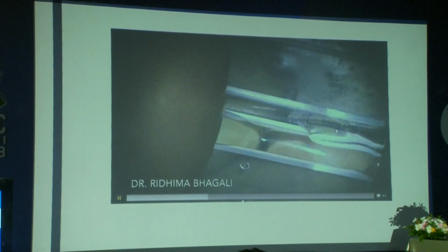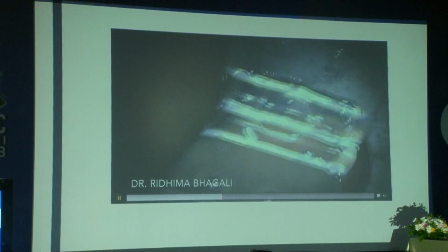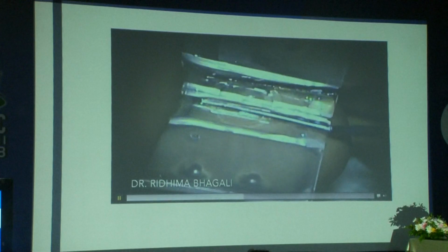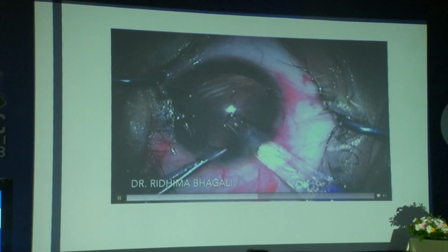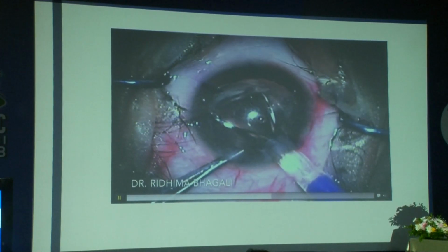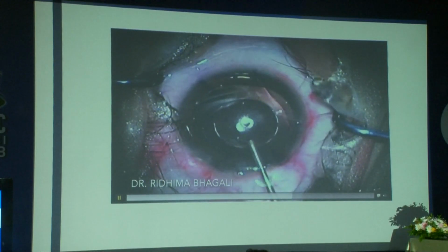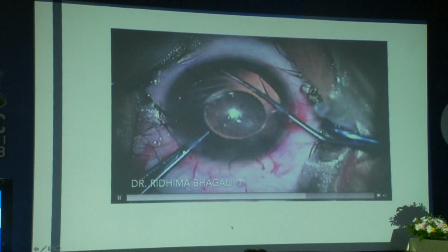Loading of the lens is quite similar to our regular intraocular lenses, but you need to ensure that it is convex side up. And again, I'm loading it like a regular IOL, like a taco. Just ensure that the edges are in. Press down the lens and gently, gradually inject it into the anterior chamber, ensuring that the mark is on the leading left haptic and it's opening, unfolding the right way. Visco over the lens and tucking in the haptics. So I'm not going into the surgical part of it.